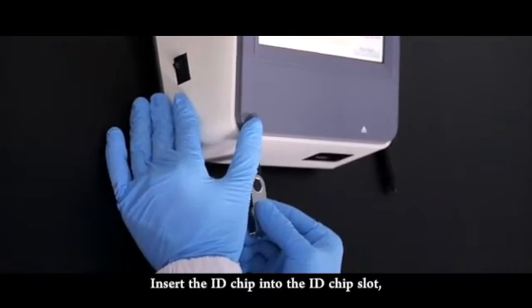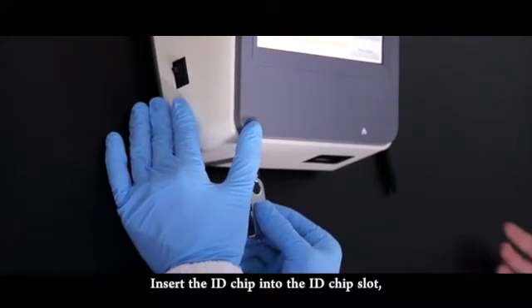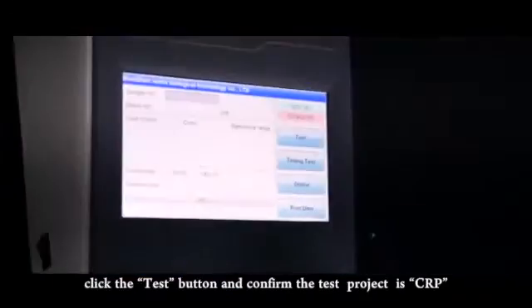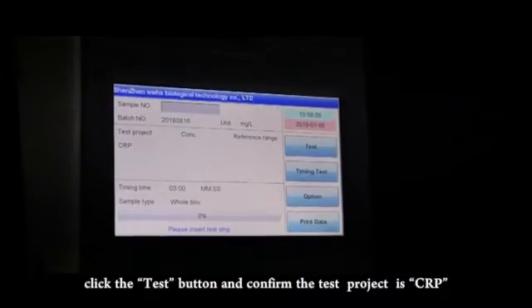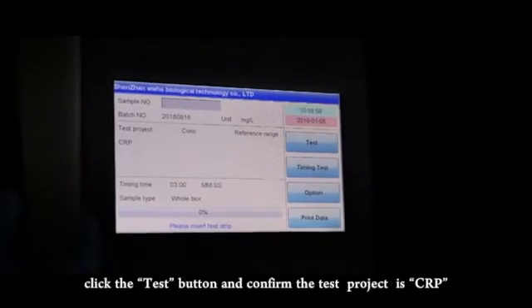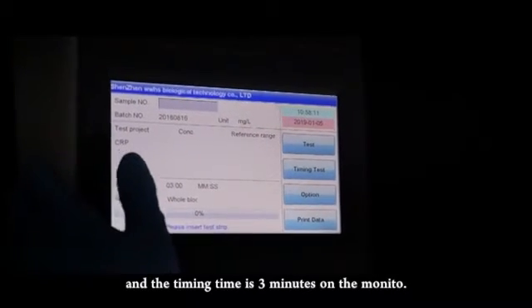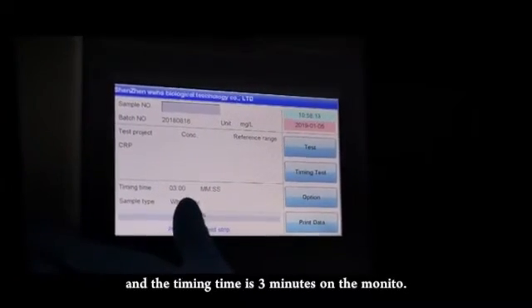Insert the ID chip into the ID chip slot. Click the test button and confirm the test project is CRP and the timing time is 3 minutes on the monitor.